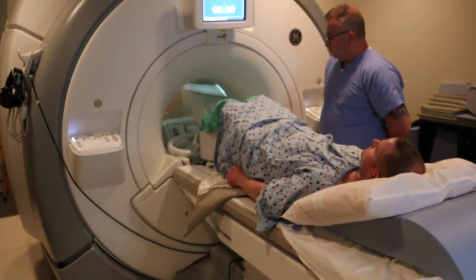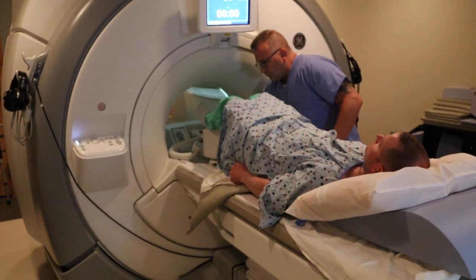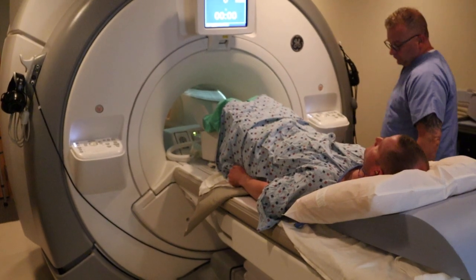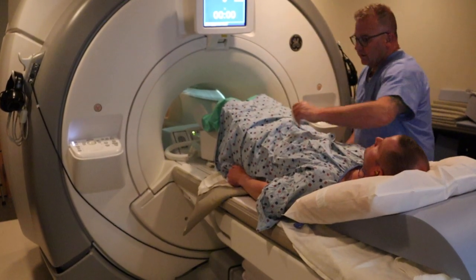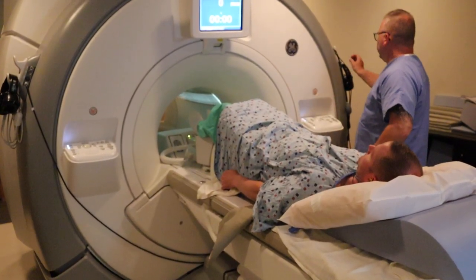It's going to be the same landmark: three fingers above the iliac crest. Now if the patient's knees are too high, you can always put a pillow underneath their ankles. That will allow them to lower the knees to help them fit a little bit better.